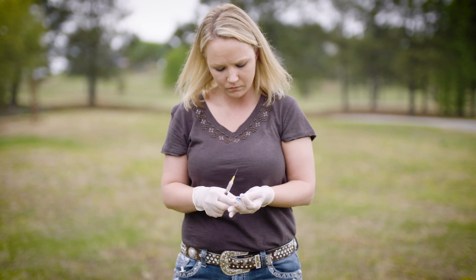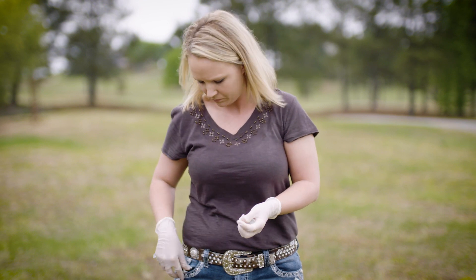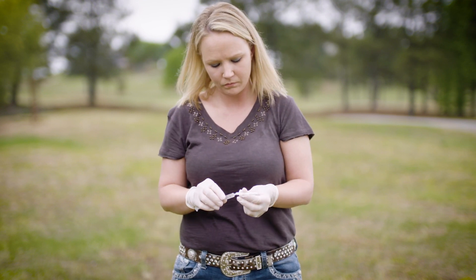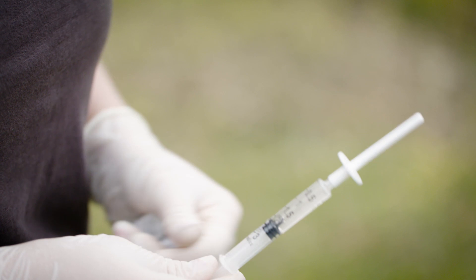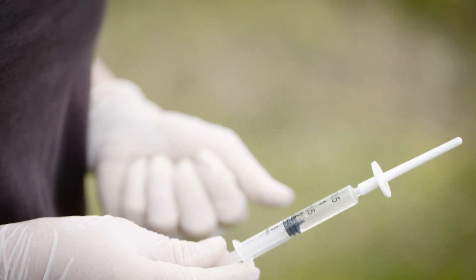Be sure to handle the cannula only by the collar to prevent contamination. The cannula allows for proper placement of the vaccine in the nasal cavity. Switching to a new cannula between cattle will minimize the chance of spreading disease through the process of vaccination.